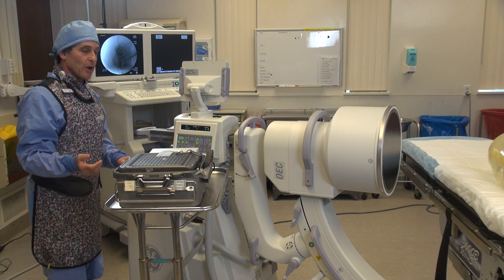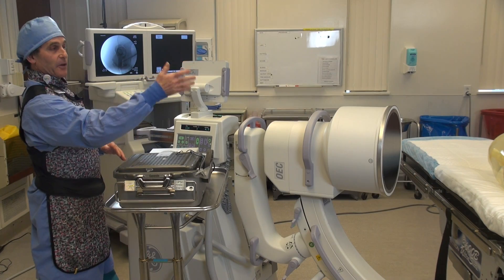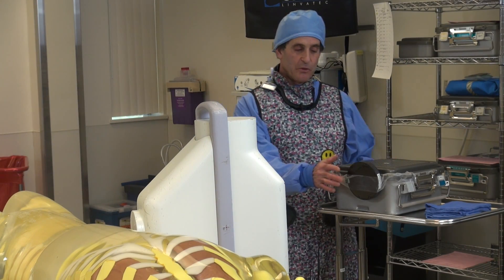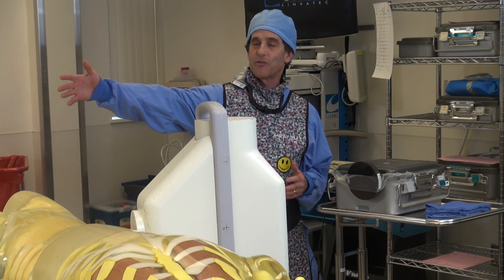Now we're going to move the ion chamber over to the other side of the room — exactly the same setup but four feet on that side. You can see we've moved it over, and again we're at four feet away. Four feet is where the tech would normally be.